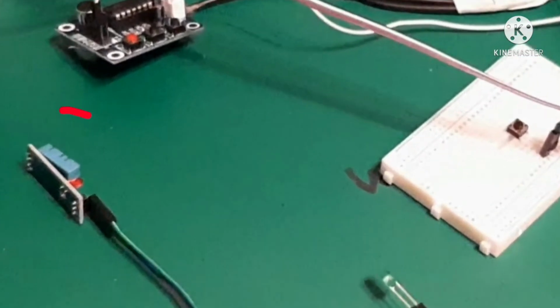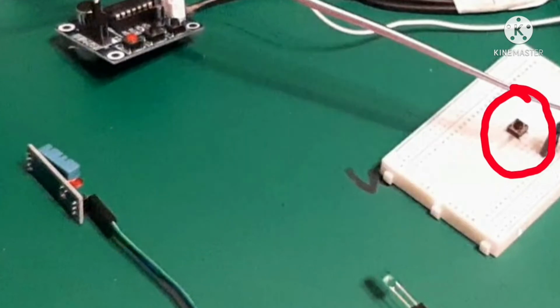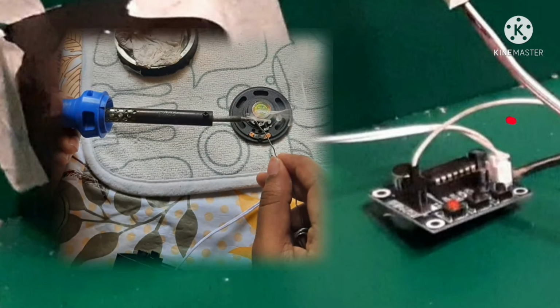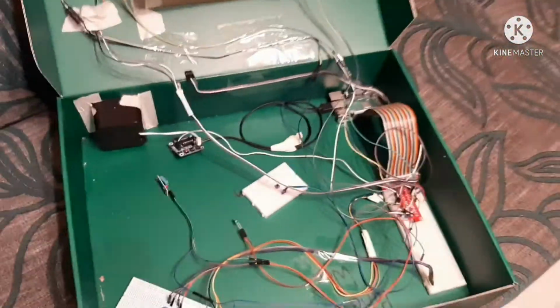Here, you can see a DHT11 sensor which detects for fire and a small button which triggers to stop the buzzer. And lastly, we come back to this speaker, which is actually an old amplifier that I soldered to the ISD1820 device. Now let's run the code and see how it goes.